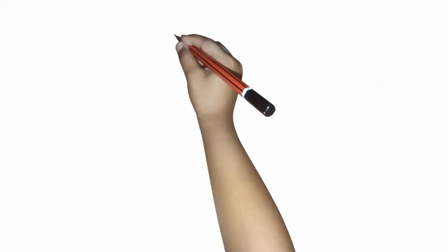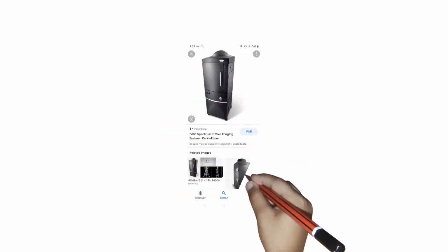or directly in tissues. So before going to perform that, you can just see the whole body or whole imaging without killing the animals, so that after the washout period you can also use these animals for any experimentation. So this is one of the approaches where you reduce the number of animals used in the study, so the remaining animals you can use for other studies.